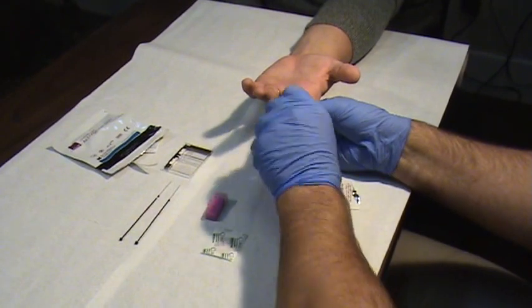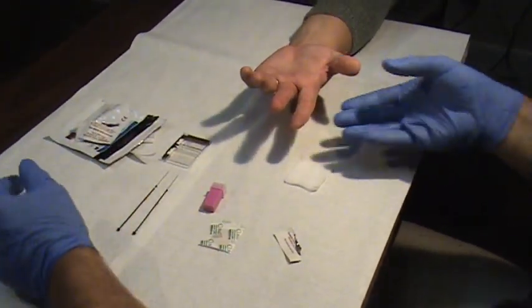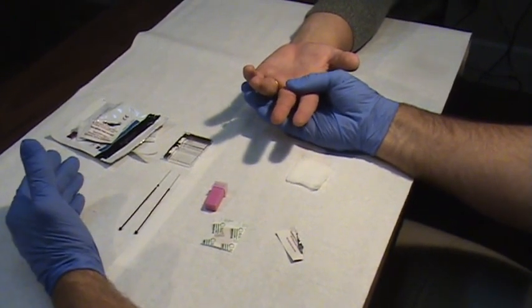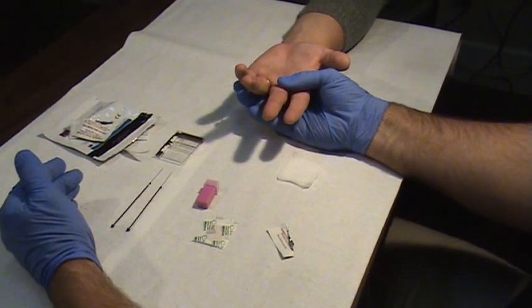Go and clean around the finger nicely. Don't touch it again. Wait for it to dry. You don't want any of the alcohol to show up into the blood sample, but you'll see that it dries very quickly.